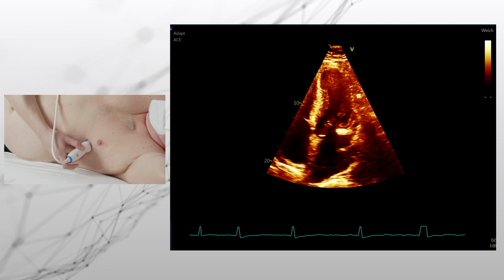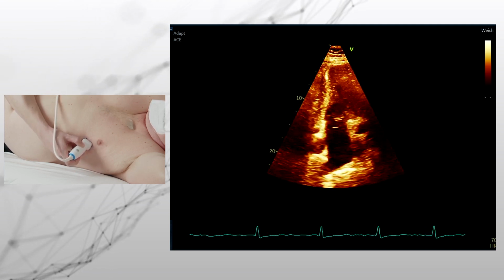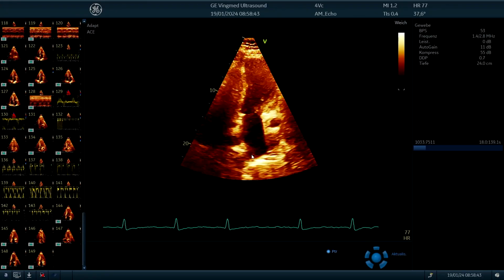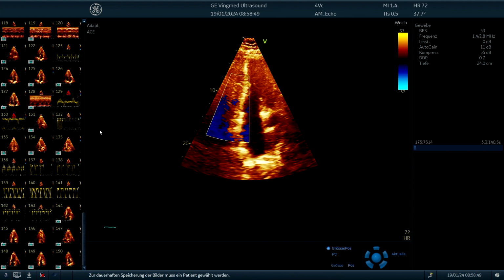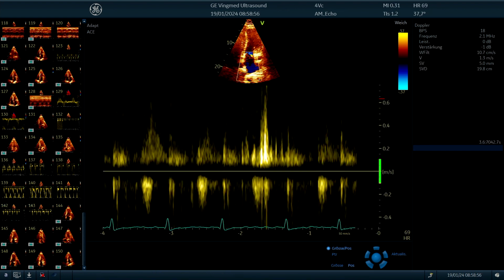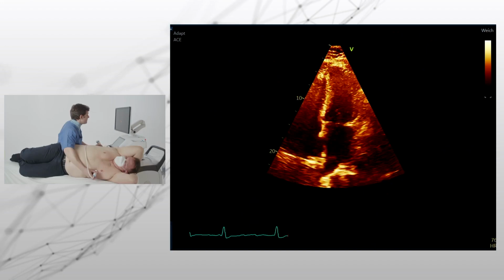One thing I forgot initially, what we also want to do is an optimized image of the left atrium. We do see the left atrium over here. This is the left atrial appendage. We also have the pulmonic veins entering. So also in this case, you can see and measure the pulmonary venous signal. And here it would be, but still it's also here not an optimal signal. But you can see it in more instances.